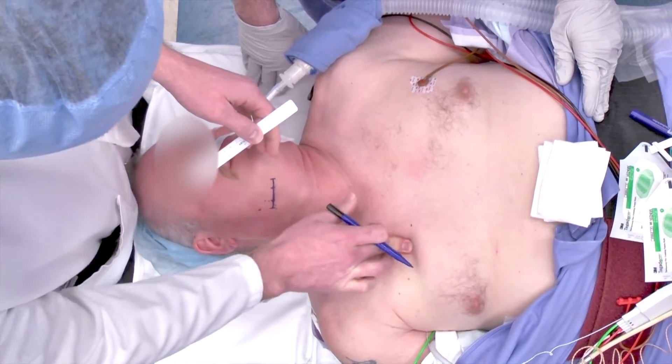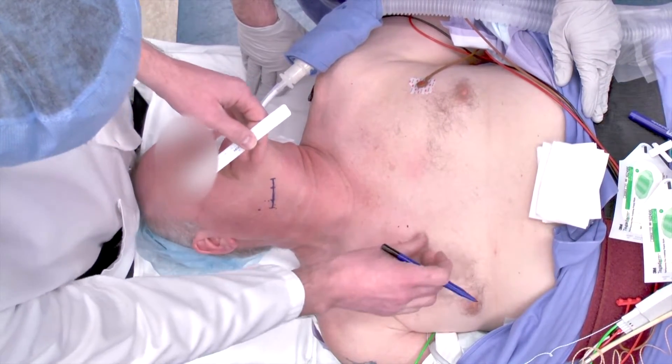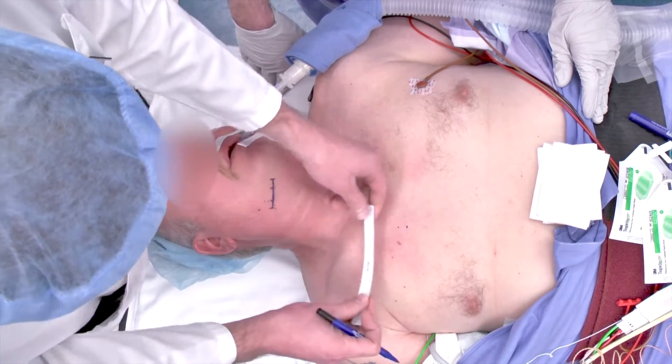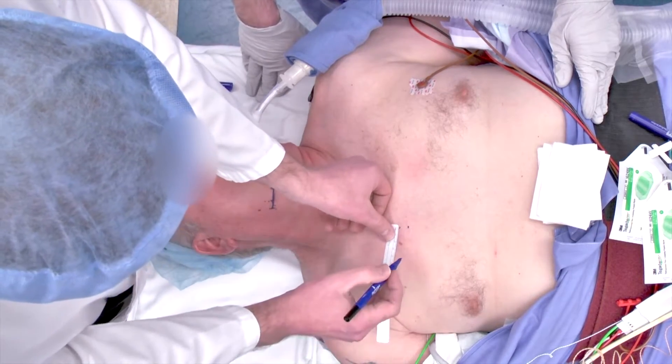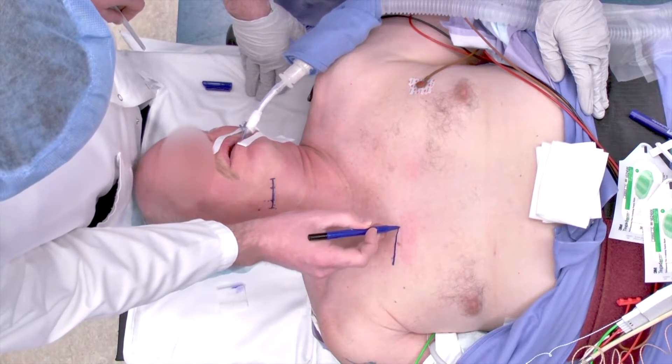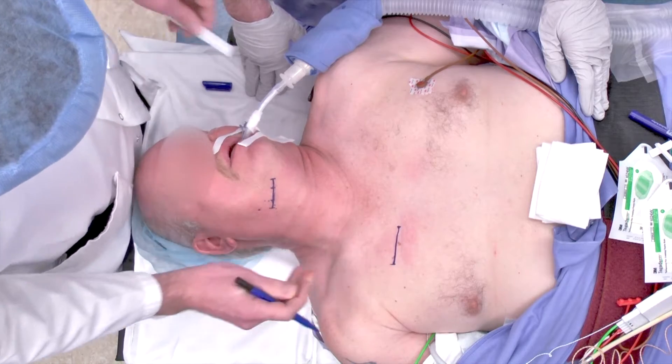Next, we mark out the incision on the chest, which is typically four centimeters in length, and slightly lateral to the sternum, overlying the rib space on the anterior chest. This generally is approximately three finger breadths below the collarbone or the clavicle.